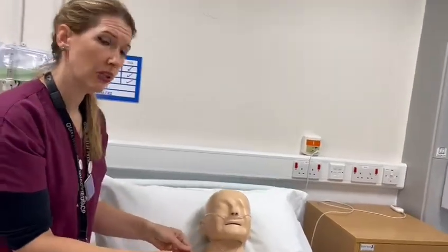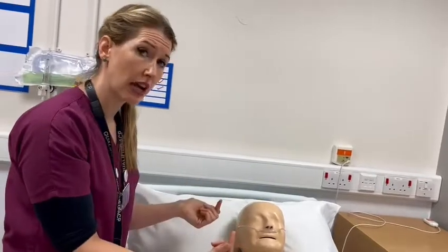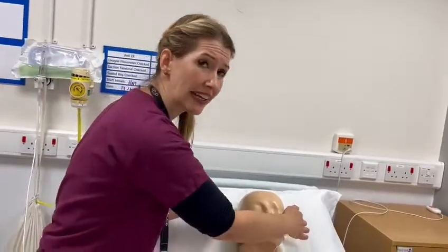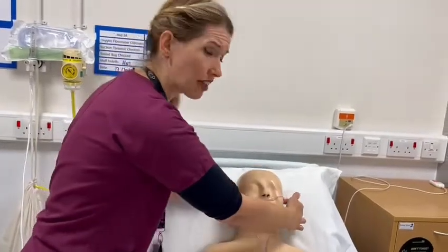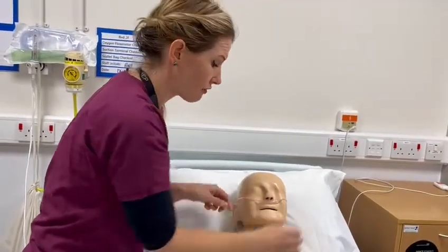Another thing just to be cautious of, if a patient is on nasal cannula long term, is just to remember they can get little sores behind their ears, so sometimes they need a bit of cushioning, and it's just a site of pressure sore, so do be cautious of that.